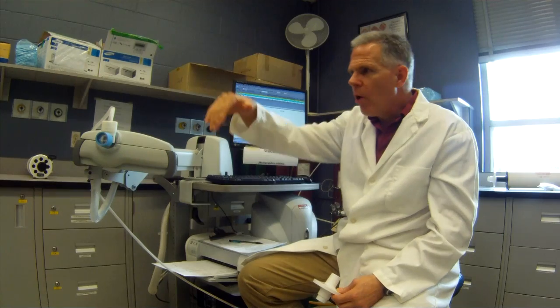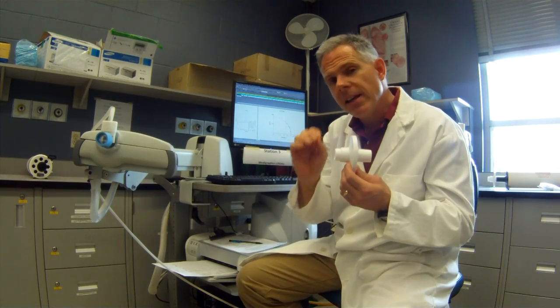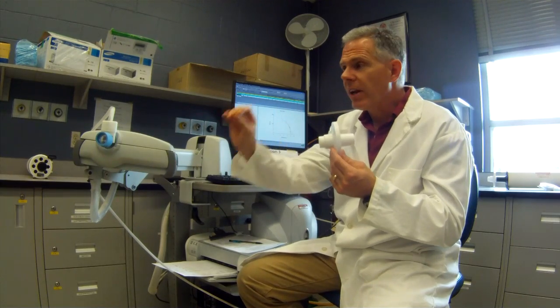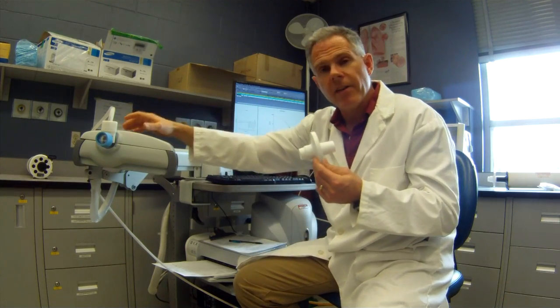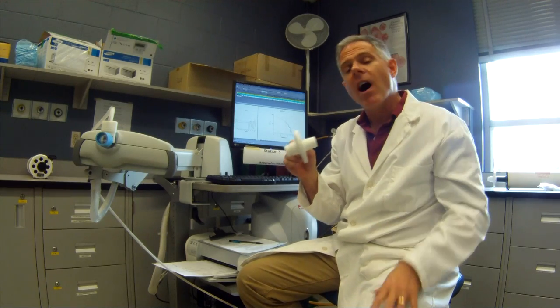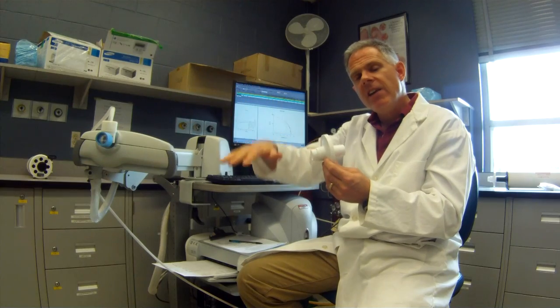Then when they're ready, when they've blown out to FRC, we can tell on the machine, we just have them keep breathing in and out, in and out. But a key thing to tell the patient is that at a certain point, they're going to hear a little clicking sound inside the device, and they're going to be breathing through the regulator. So they're going to be breathing a dry gas, and it's 100% oxygen that they're going to be breathing. So nice, even breathing.